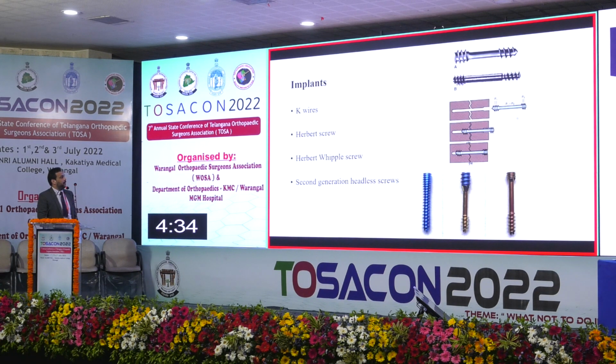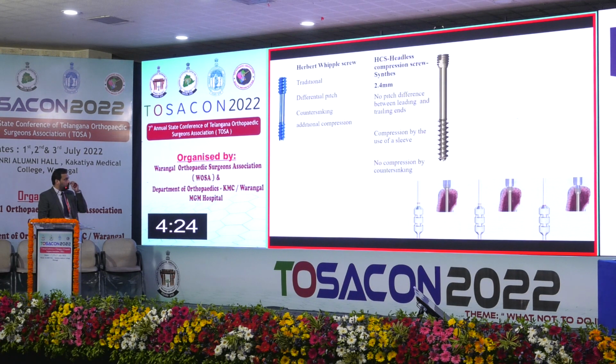So there are very many kinds of implants. K-wires are still used. The original Herbert screw was a non-cannulated one. Then came the Herbert Whipple, which was a cannulated version. And what we use now is second generation headless screws. So you need to know what screw you are using.